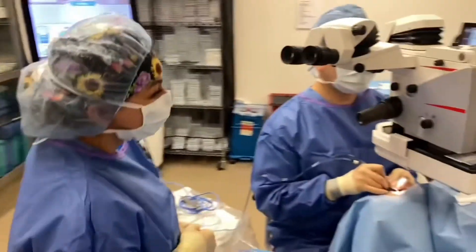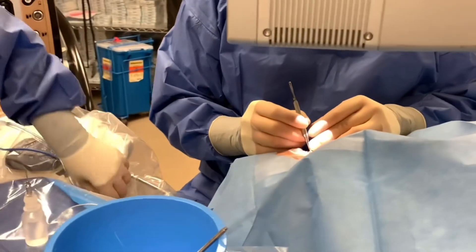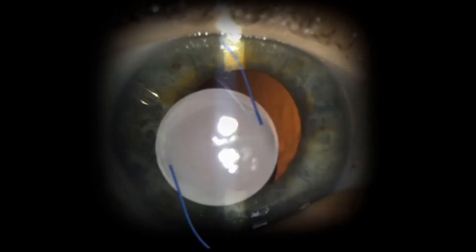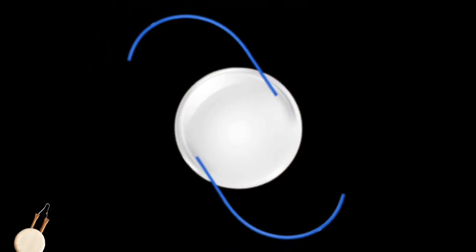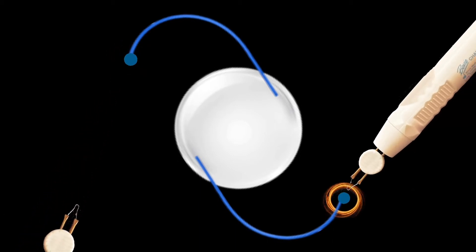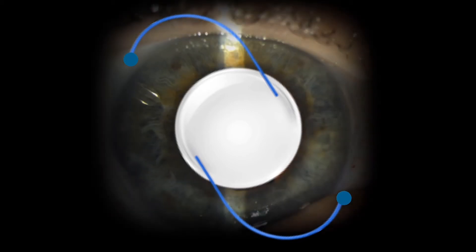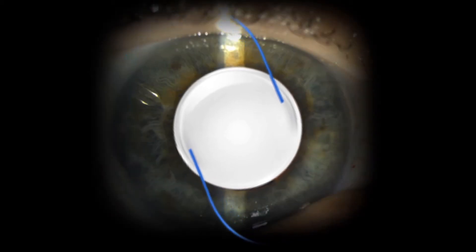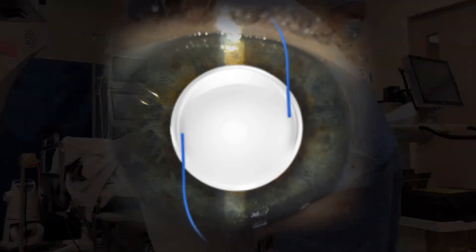More recently, we have a technique called the Yamane technique whereby no stitches are needed. The way this works is we take each haptic and externalize it through a small scleral tunnel. Once the blue prolene haptic is externalized through the scleral tunnel, cautery is used to create a terminal flange. Now that the flange has been created, the haptics can be placed back through the scleral tunnel and the flange is buried underneath the conjunctiva. This creates a perfect anchor to keep the lens optic perfectly centered in the center of the eye.